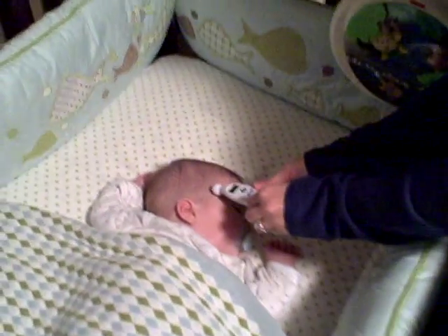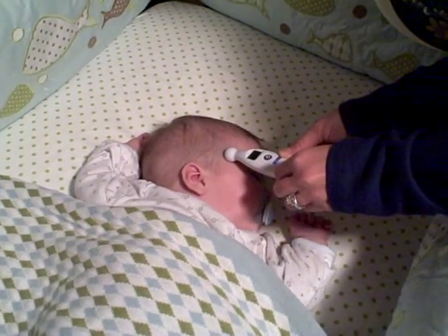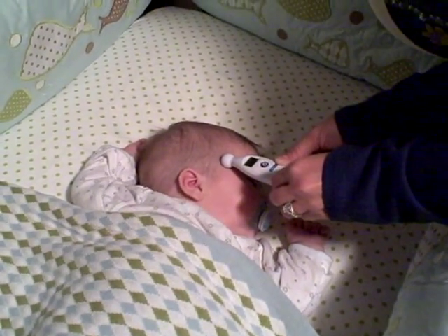Now you gently press the probe of the thermometer to the temple. Then you're going to wait about six to seven seconds until you hear two more beeps with your temperature reading.